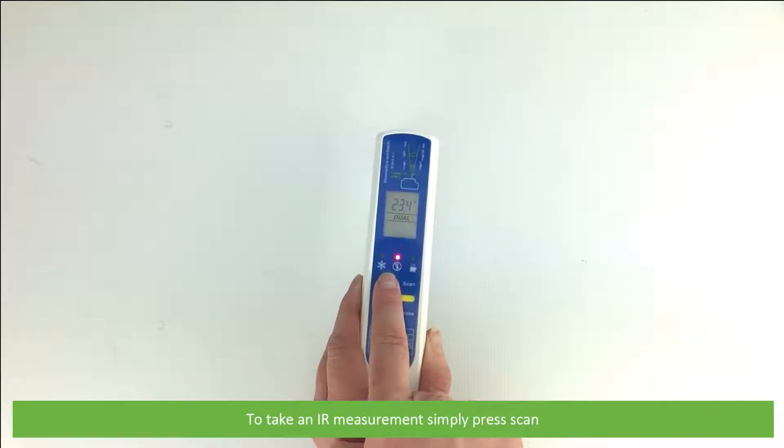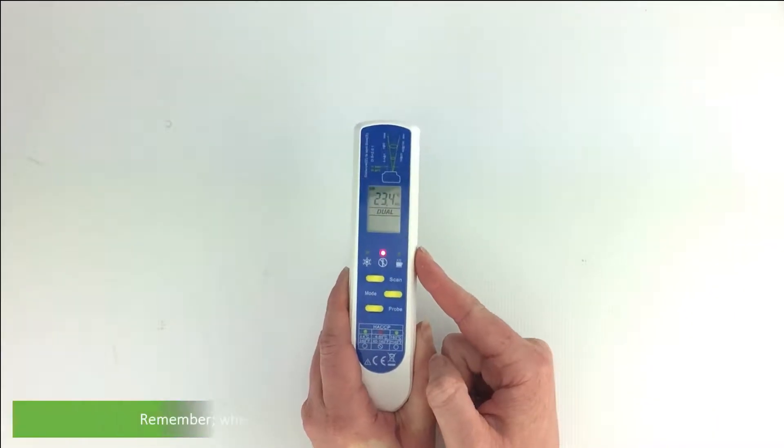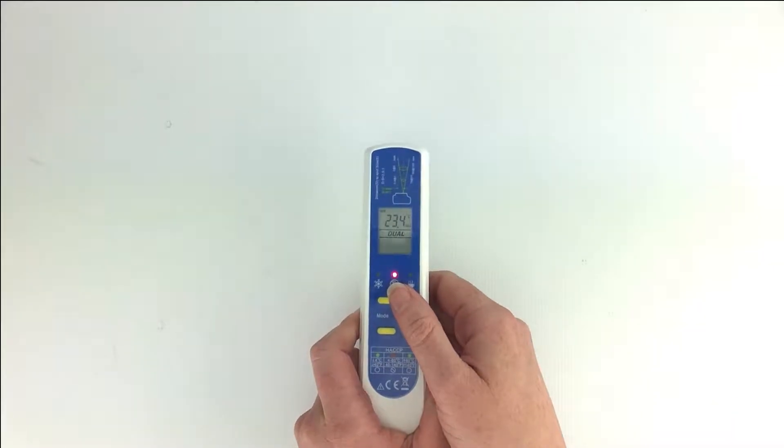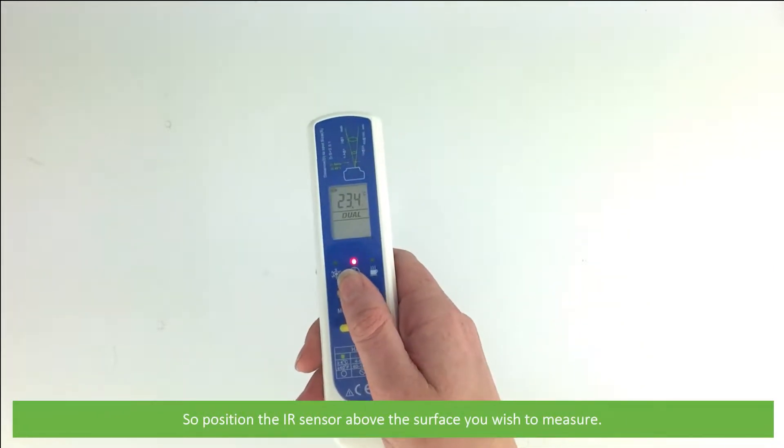To take an IR measurement, simply press scan. Remember, where a lot of devices have the IR lens on top, this is placed below. So position the IR sensor above the surface you wish to measure.